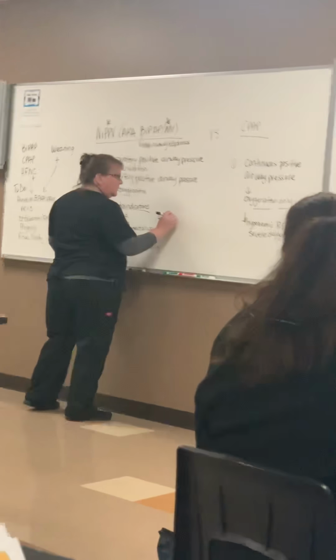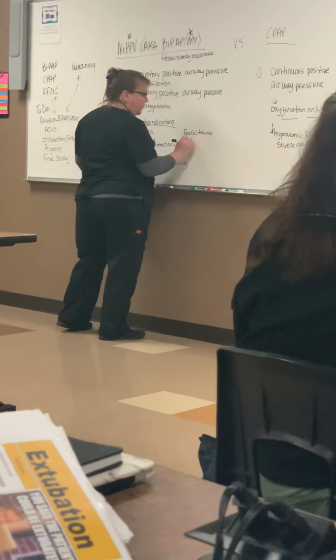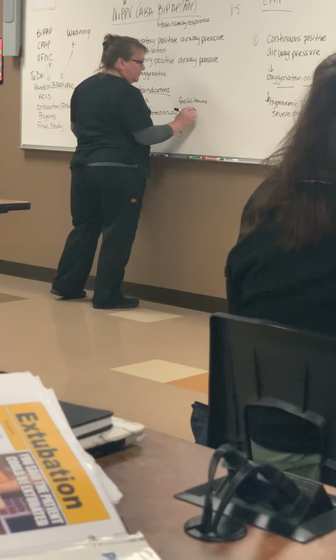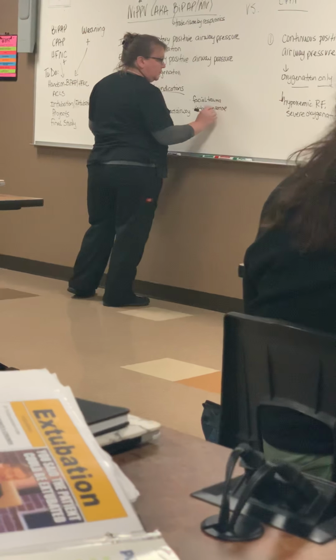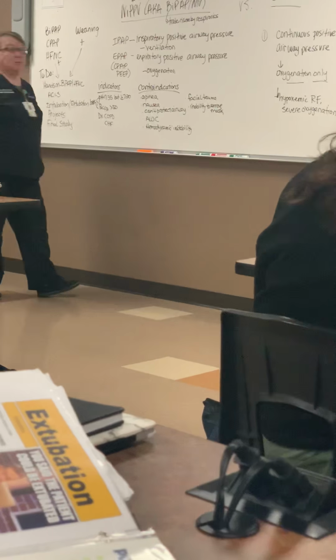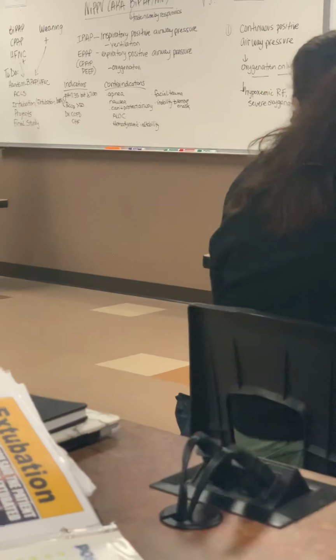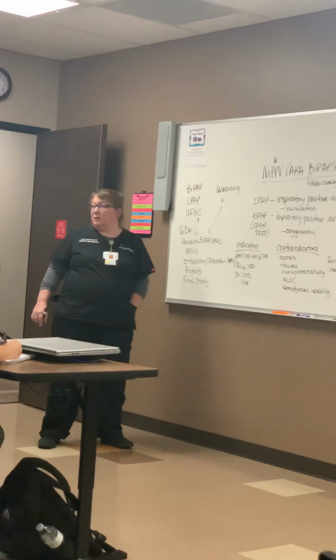Facial trauma, inability to remove the mask. Is that under the compliance thing, like if they can't remove the mask, is that more like they don't understand what's going on?